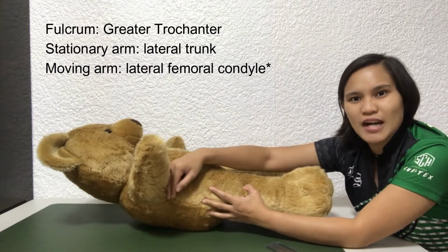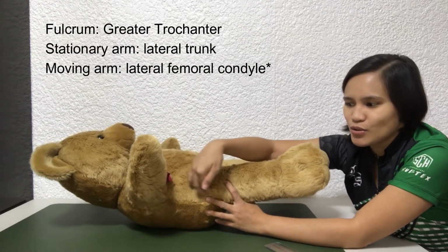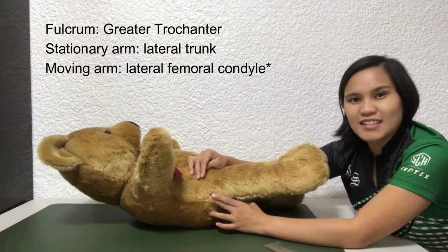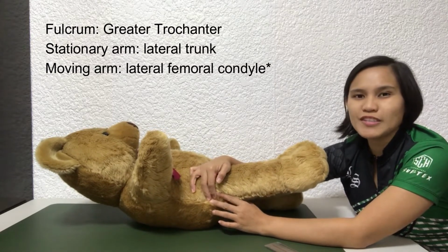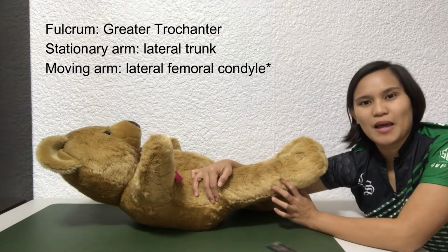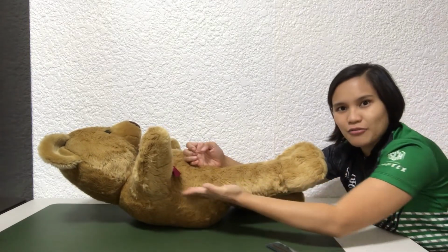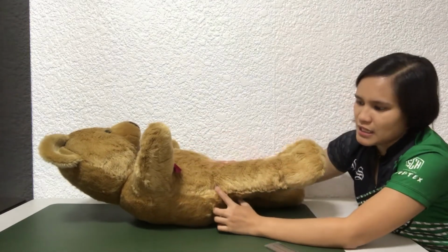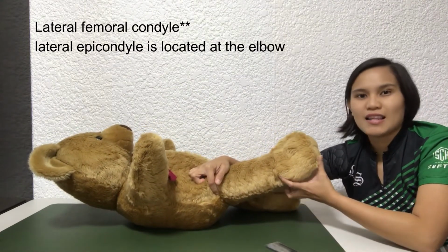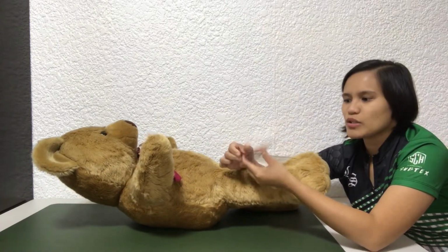And then the stationary arm or proximal arm should be aligned parallel to the lateral trunk of the person. And then the distal arm or the moving arm of the goniometer should be aligned on the lateral epicondyle of the person. So, for example, this is the lateral trunk of Mr. Teddy. This is his greater trochanter, and this is his lateral epicondyle. So, we will align the goniometer. This is what we do.